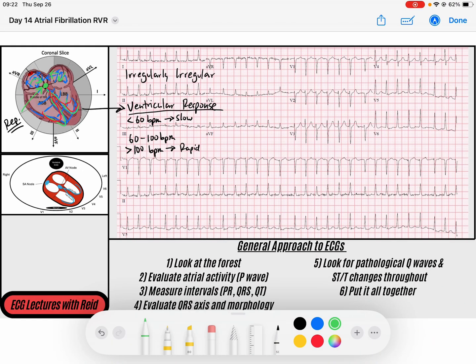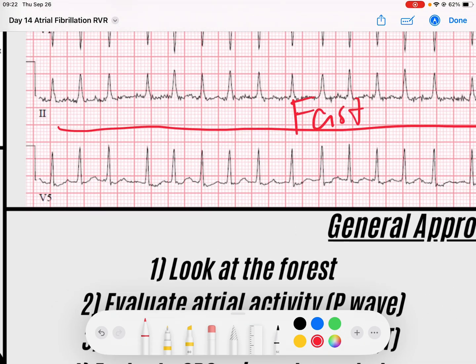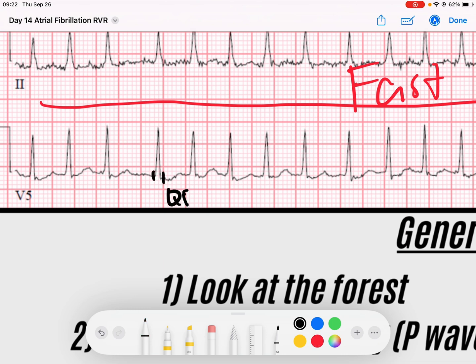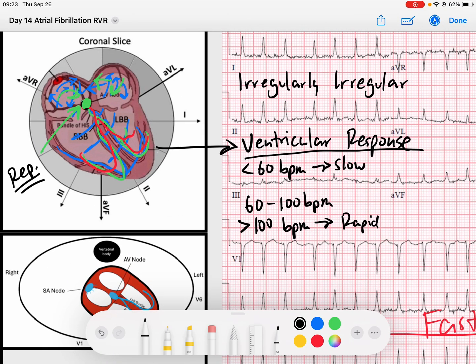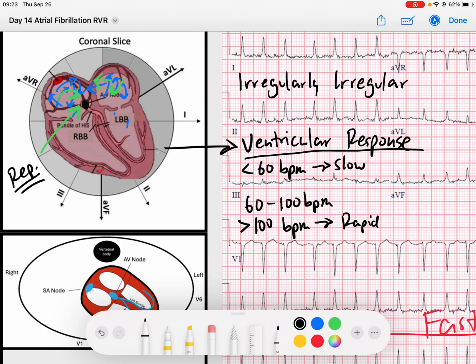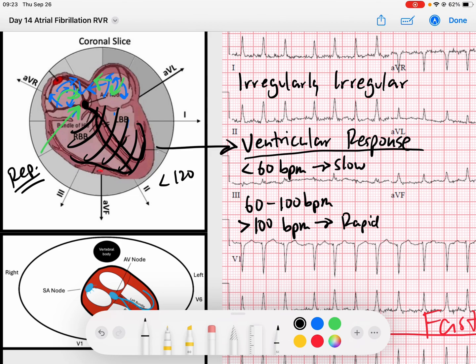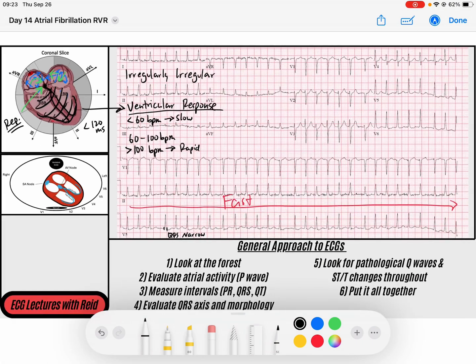Let's take a look at this EKG. As I scan through, the first thing I do is get an idea of the rhythm. I notice that it's very fast — not hard to see this is a very fast rhythm. If I look more closely, I notice that my QRS complexes are narrow. A narrow QRS tells me we're getting rapid conduction through the ventricles, which generates the QRS complex. That rapid conduction occurs due to the specialized His-Purkinje fibers. Anytime the AV node sends signal down the bundle of His, the right bundle, the left bundle — that is our His-Purkinje fibers — it generates a rapid QRS complex less than 120 milliseconds in duration.